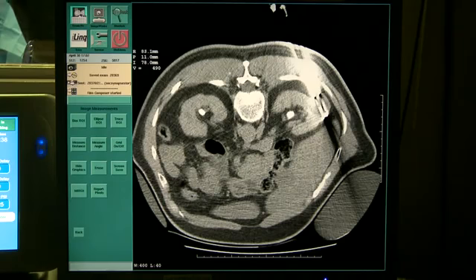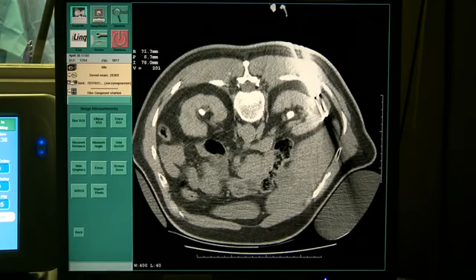It's 14 millimeters from here to here. If this were a single probe, that wouldn't work, because you get a 24 millimeter wide lethal ice ball, 12 on each side. But since there's two probes here, that will almost certainly work. There's a third probe just above it. 1 plus 1 is 3 when it comes to cryo probes.